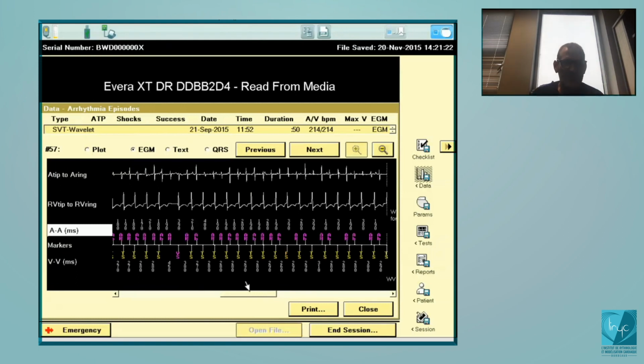So the same step. First one, atrial rate is faster than the ventricular rate. Okay, there are some details, but I will not give you all details. So, okay, is there something like an oversensing, far field oversensing? No, there's no repetition, long, short, long, short. Okay, is this compatible with atrial fibrillation? Yes, the counter, I think, is compatible with the atrial fibrillation.